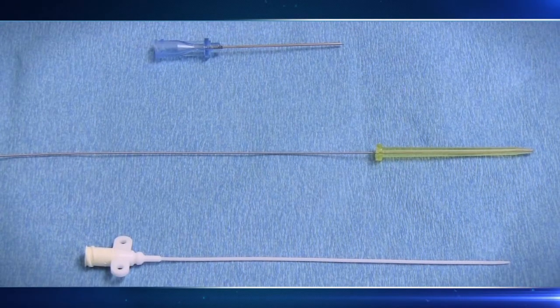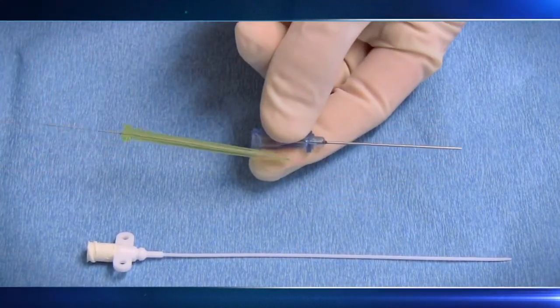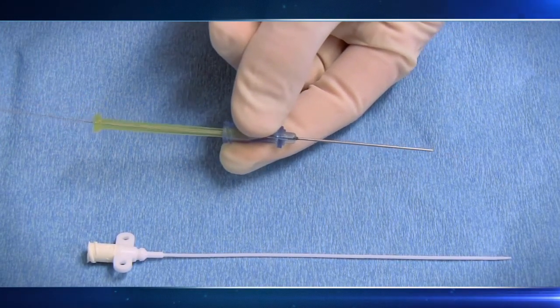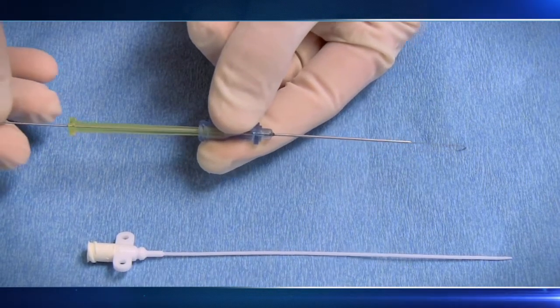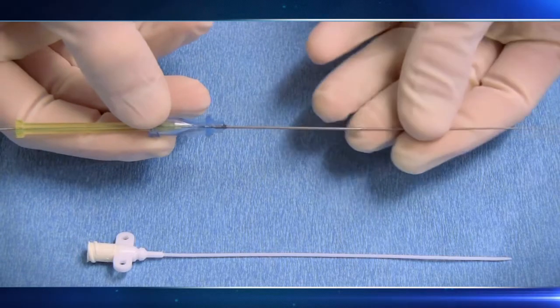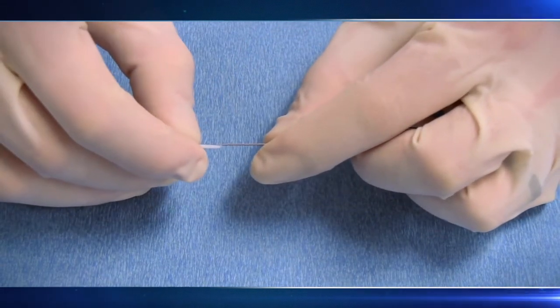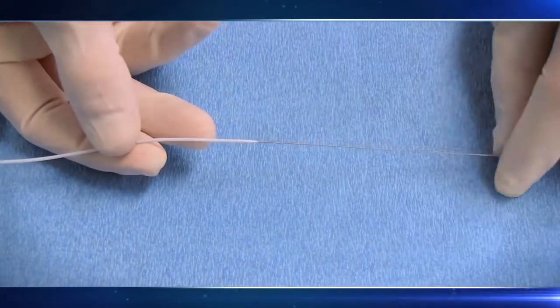The second is the catheter over wire technique, which involves cannulating the artery first with a needle, then threading a wire through the needle, removing the needle, then threading the catheter over the wire, and then removing the wire. This is also called the Seldinger technique.